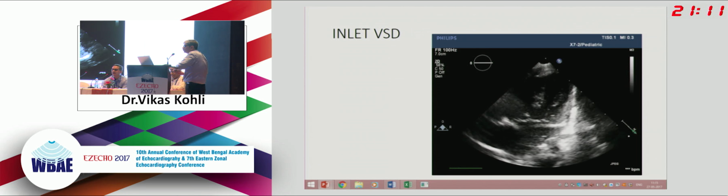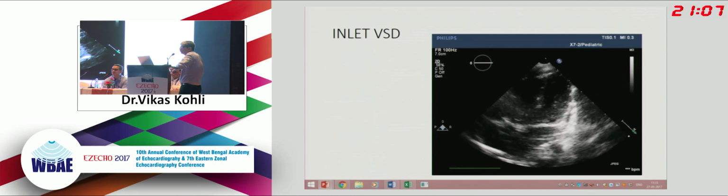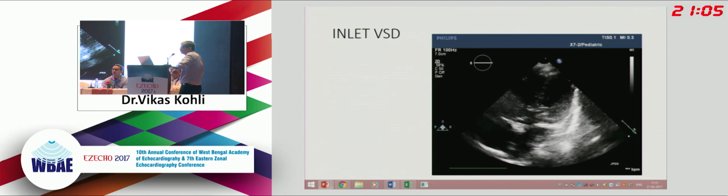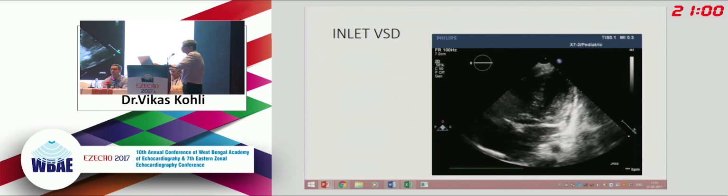This is a picture of inlet VSD. This is a complete AV canal, as you see, a common AV valve, and you can see that there is a large inlet VSD and primum ASD as well. So this is a tetralogy with complete AV canal.